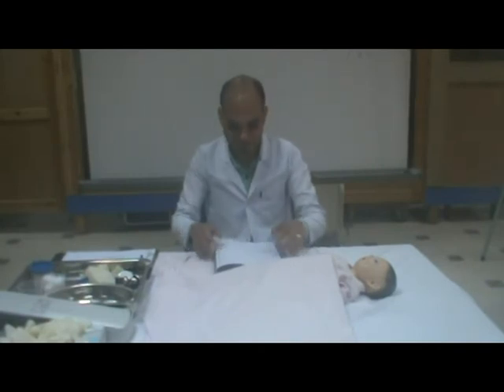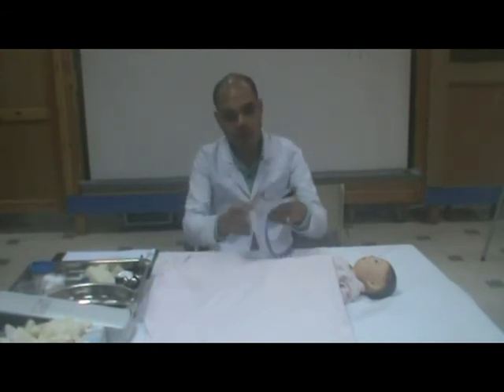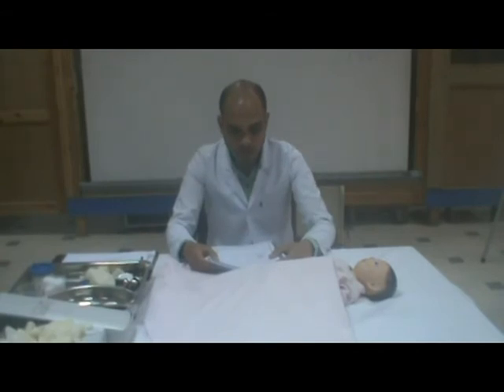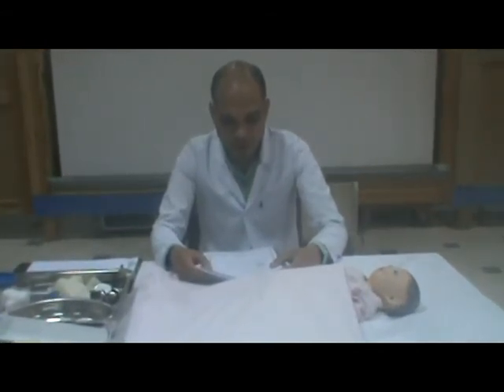Rectal temperature shouldn't be used in children who are having rectal surgery or receiving chemotherapy. The procedure should be done by rectal thermometer. Measuring rectal temperature is generally unnecessary because of the risk of rectal perforation and sexual abuse. Look at your procedure book for a figure that shows a cross-section of the rectum.